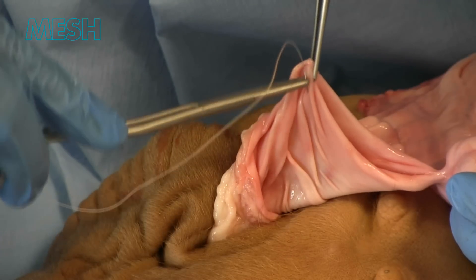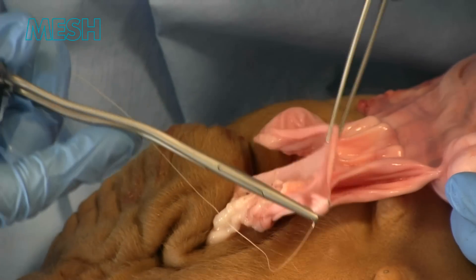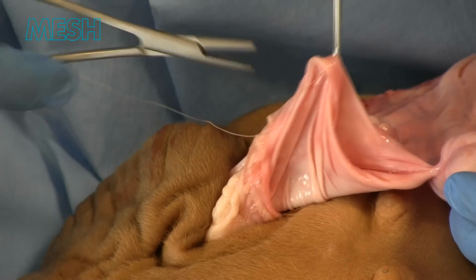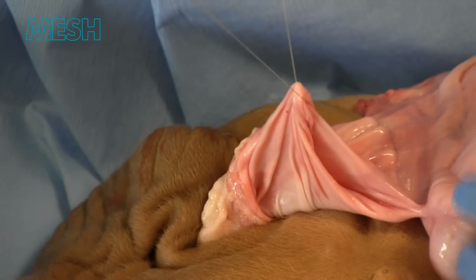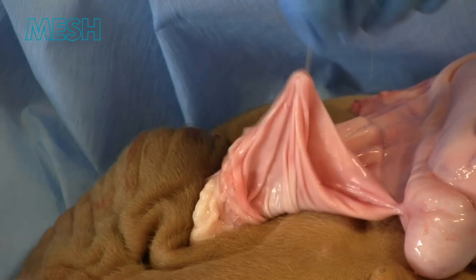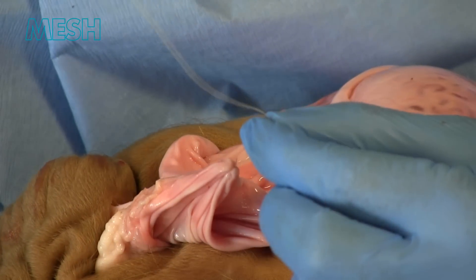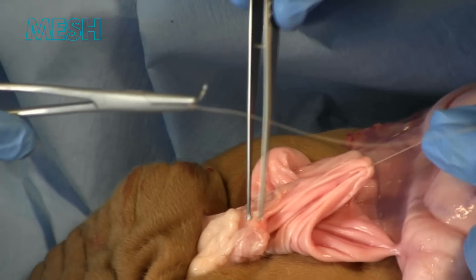The tunica vaginalis is then sutured together. This is performed with a 2-0 vicryl suture in a continuous fashion. Some of the sac can be excised if it is very large. We are showing here a Jabberlay repair. However, another option is to fold the layers of tunica vaginalis as a cuff, and this is called a Lord's repair.